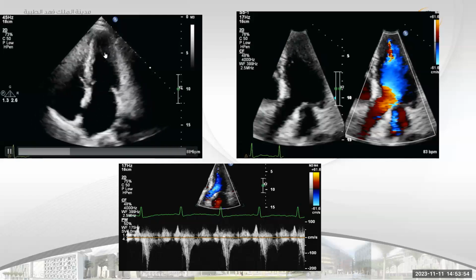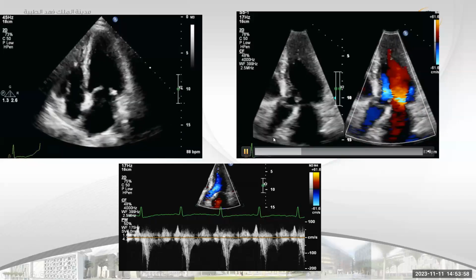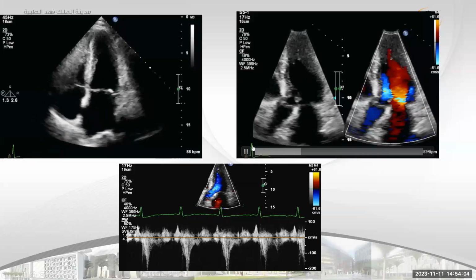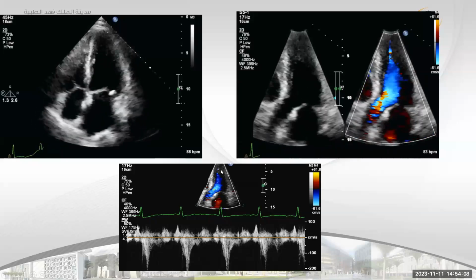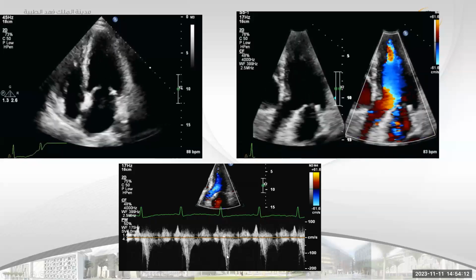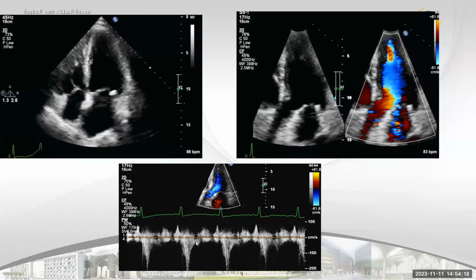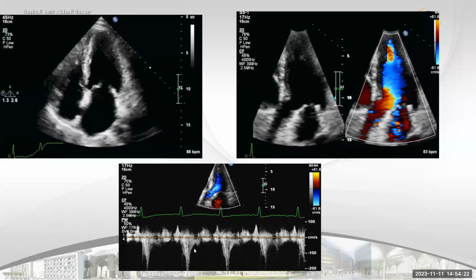especially during diastole. Okay, there is thickness of the apex, but what's more interesting and a clearer clue, you can see during systole that you have flow acceleration across only the apex. Okay, and now you see the hints. What made you confused is that yes, you have high velocity and obstruction during systole. That means likely you have high velocity. It is a bit late peaking. That means dynamic obstruction. This is what you call dagger shape again.